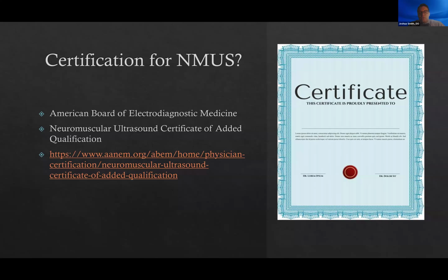Really what it comes down to is that you're certified by ABEM, and then you actually have to perform 150 ultrasounds of nerve or muscle. And this is outside of procedure, so you can't count it if you did a carpal tunnel injection. Now, if you did neuromuscular ultrasound on the median nerve and then you added a carpal tunnel injection, you could do that, but it's not procedure-based or using it for needle guidance. These are diagnostic ultrasounds.